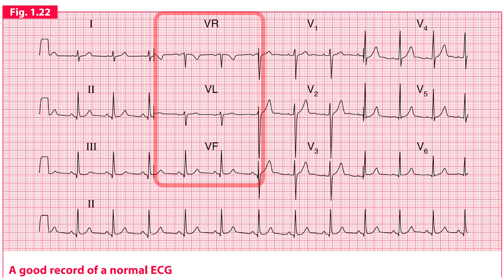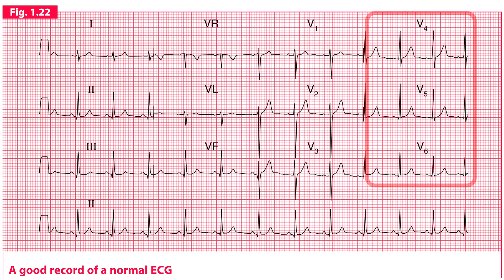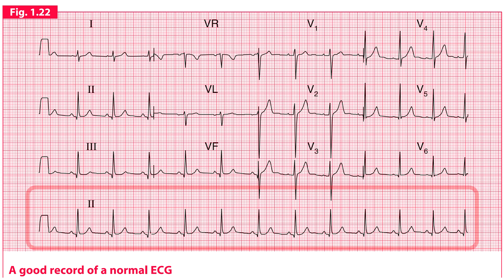Leads VR, VL, and VF are present in the second column. Leads V1 to V3 are present in the third column, and leads V4 to V6 are present in the fourth column. Apart from these four columns, there is an additional lead at the bottom which is covering the whole length of the ECG paper from left to right.